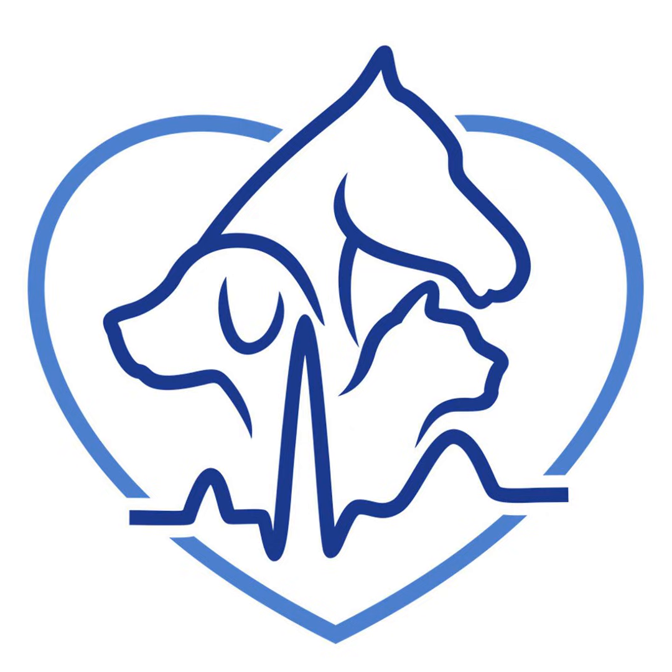So one of them was a Sphinx cat. I feel like Sphinxes do this. I don't know, maybe I'm just imagining it, but I feel like these are hypertrophic cats, and then a year or whatever later, their wall is thin now. It's not moving. You're like, oh boy. And so I've seen that, but it was obvious from the echo that that's what I was going to find.